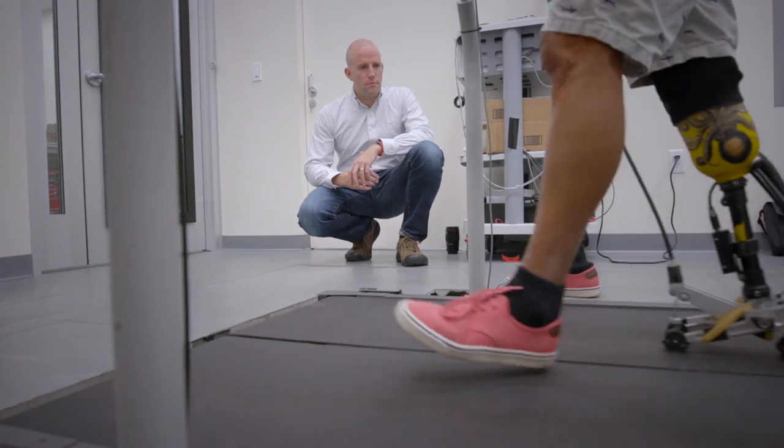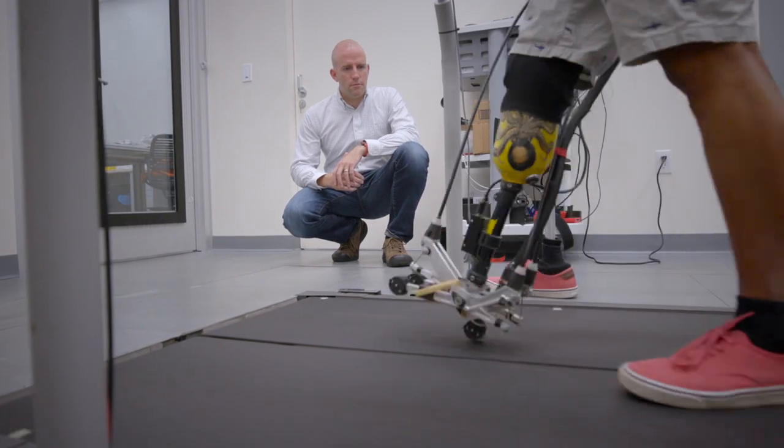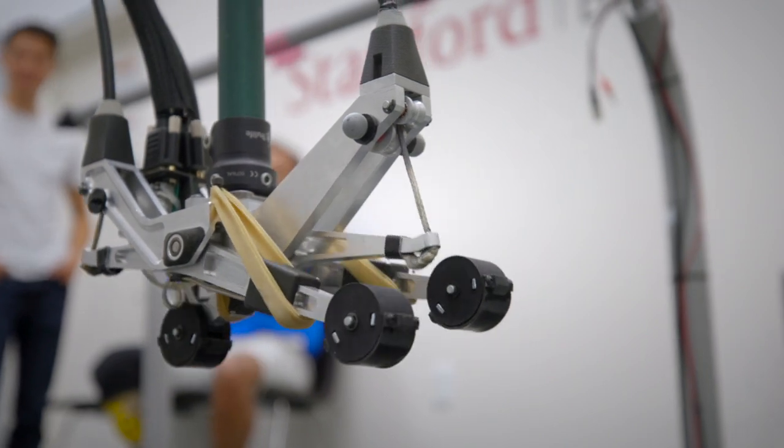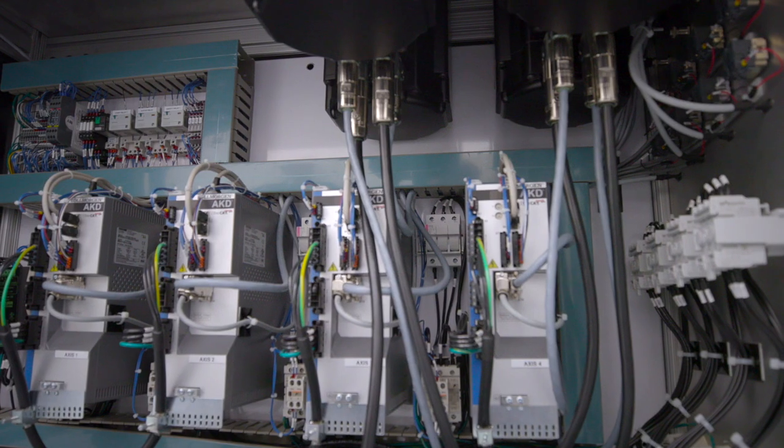We use these tethered laboratory-based devices that are highly versatile — we call them prosthesis emulators — and they allow us to try lots of different designs without the overhead of making new hardware. It's kind of a test bed, so we have it hooked up to these very large off-board motors to ensure that we never run out of mechanical power.